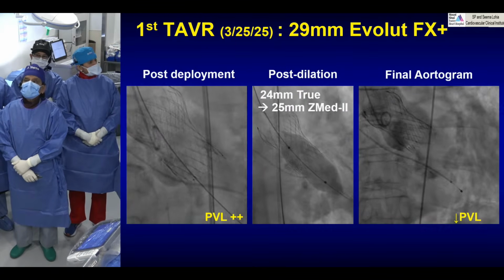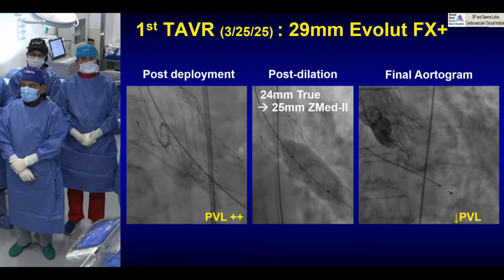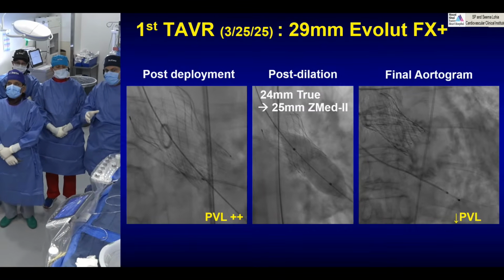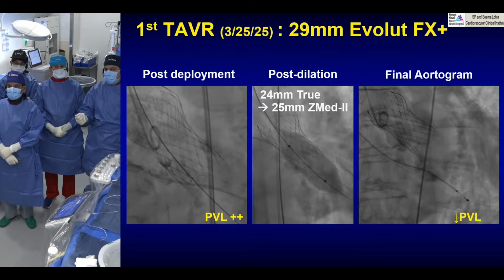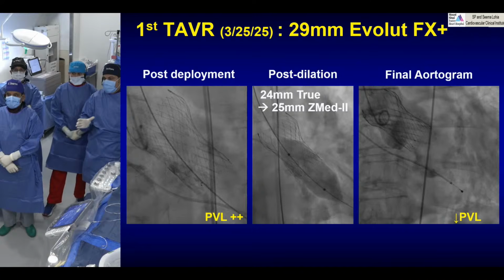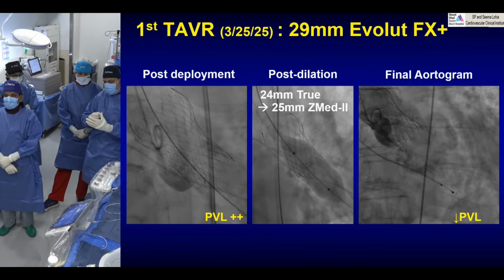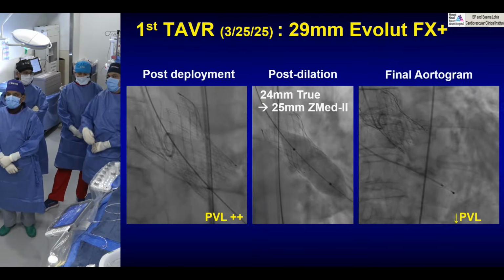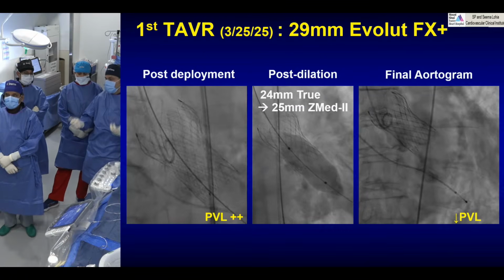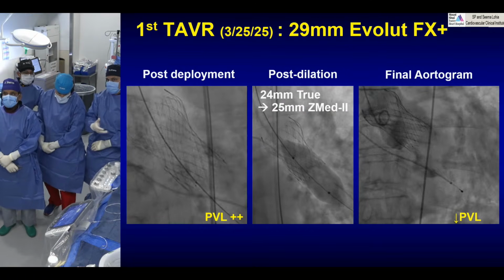I think it's a very good question, Dr. Kinney. The only issue is you have enough skirting, up to 10 to 13 millimeters, to actually cover the annulus. The issue arises when there's a lot of external calcification on the leaflets as well. The leaflets have very heavy calcification in addition to annular and LVOT. So your stent frame may or may not fully circumvent the entire annulus. There may be areas where the annulus is abutting and you have leak around it. So even though your depth may be perfect and your skirt is where it should be, because of these external features, which is the calcification, you may not have adequate sealing. And we've seen it with self-expanding platforms, this one as well as the other platform.